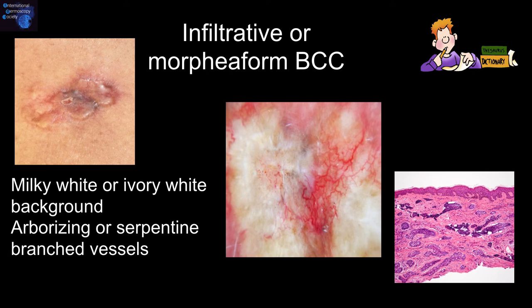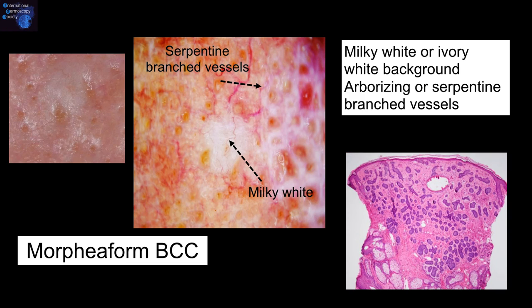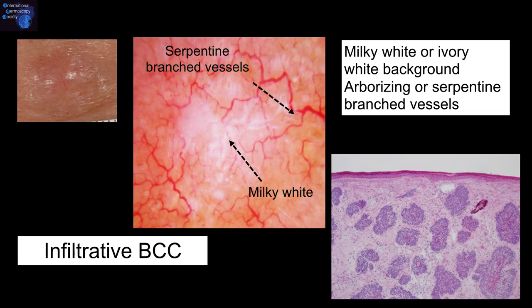Infiltrative or morpheaform basal cell carcinomas have the following features: milky white or ivory white background, and arborizing or serpentine branch vessels. In this example of a morpheaform basal cell carcinoma, we have serpentine branch vessels and a milky white appearance. Similarly, in this infiltrative basal cell carcinoma, we have serpentine branch vessels and a milky white appearance.